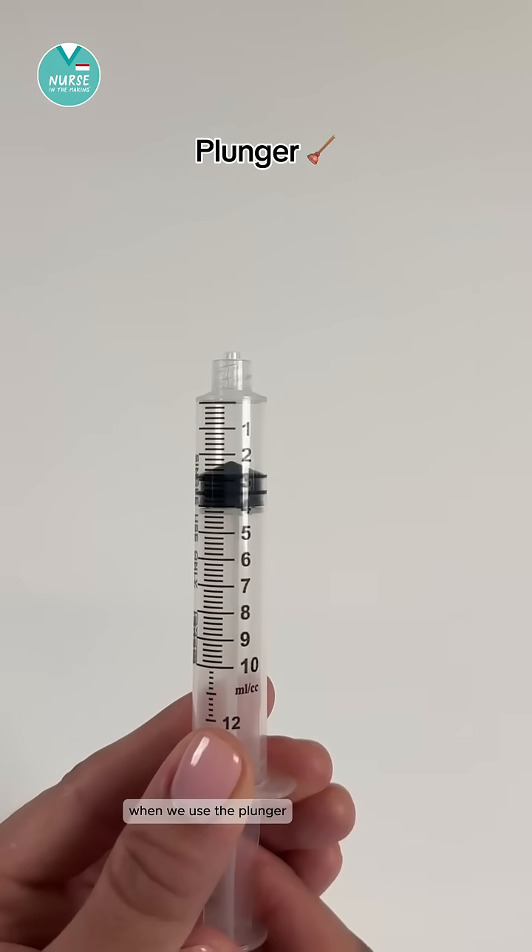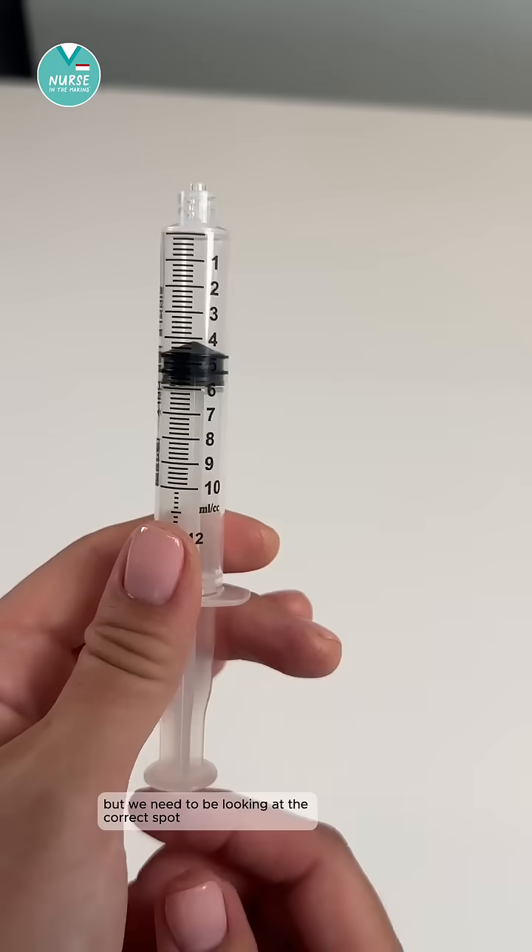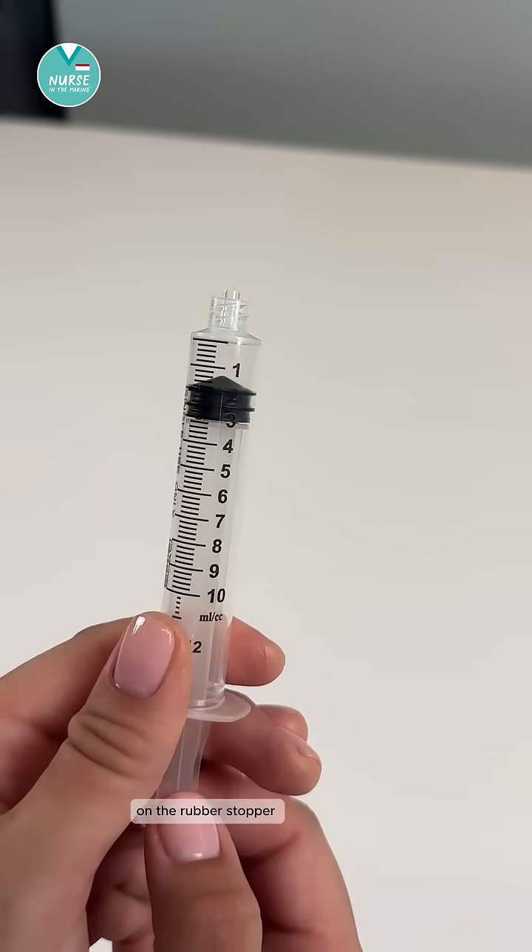Now let's look at how to read a syringe when we use the plunger. The back stopper at the top of the plunger is our indicator, but we need to be looking at the correct spot on the rubber stopper.